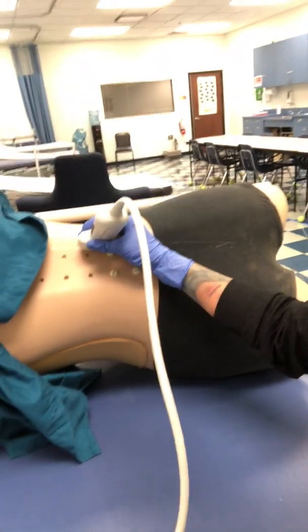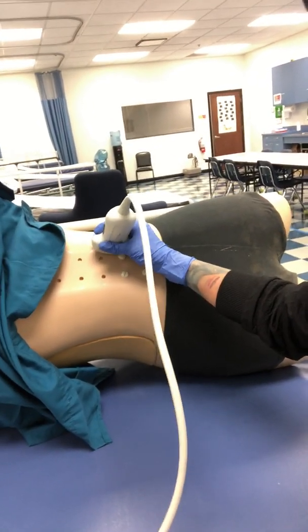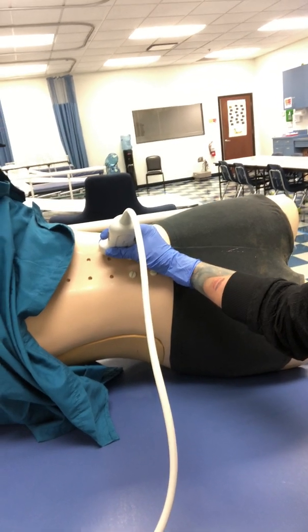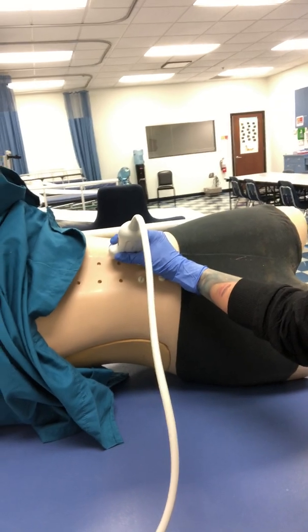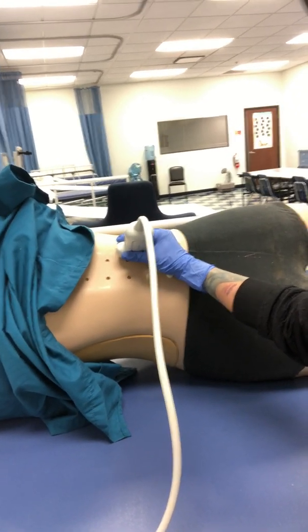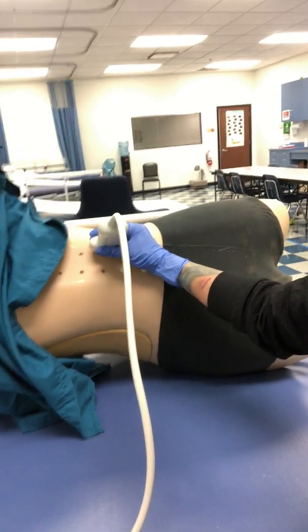But you can see here my notch is pointing up towards the patient's head, but now my beam is going from the patient's posterior, and now I'm scanning from the posterior towards the anterior because we can't scan any more posteriorly. It won't go posterior to posterior, but my approach is through the patient's back or posterior, and I'm scanning forward, which would be the patient's anterior portion.